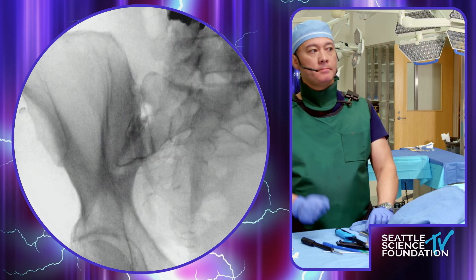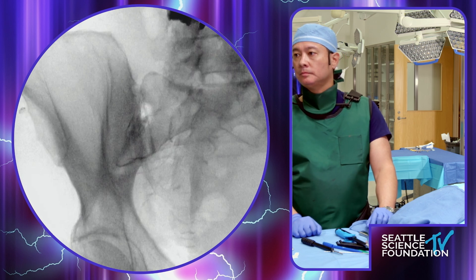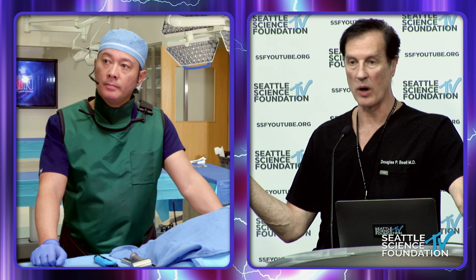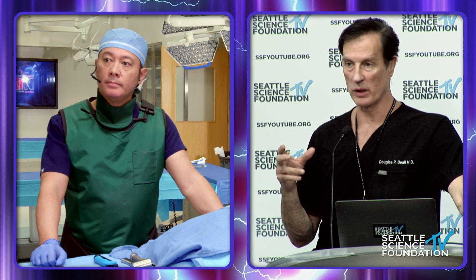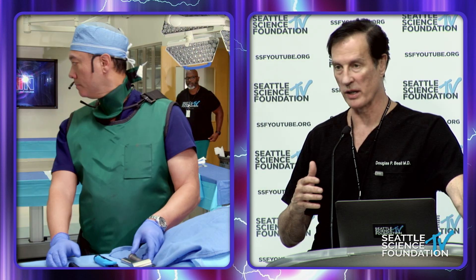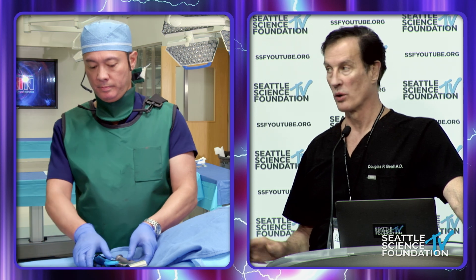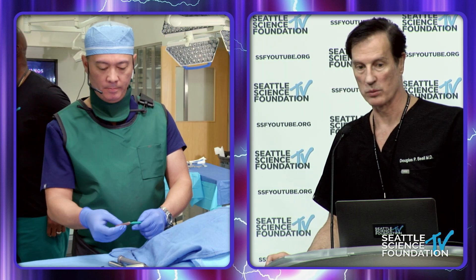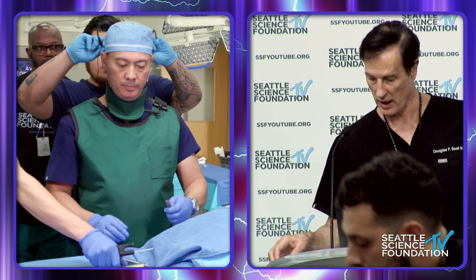In orthopedics we rely primarily on autograft harvested at the time of spine surgery or reconstructive surgery, and in revision circumstances we augment with bone graft substitutes or bone-stimulating protein. For the graft placed in this approach you can use DBM or DBX — I use a combination of synthetic and biological, like NanoFuse, and fill a big wide graft window. Some of the screws used in the posterolateral and lateral approaches are self-augering and take cancellous bone from the ilium — God's best bone graft ever. We'll use graft for those that don't self-auger. Alright guys, we're going to transition to the posterolateral and then the lateral approach.